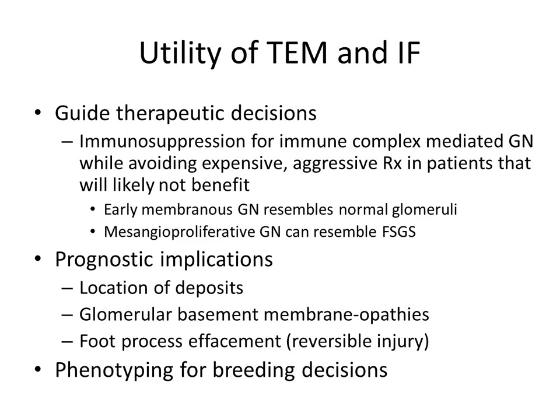Some of the other things as pathologists we want to know is, is the location of deposits going to tell us anything about etiology? Is it going to tell us something about prognosis? We see a proportion of our cases that have really abnormal GBM, whether or not it's type 4 collagen mutations that have been documented, and we have a lot of colonies of Alport's-like disease or hereditary nephritis, but we have some dogs that have abnormal GBMs and we can't figure out why.